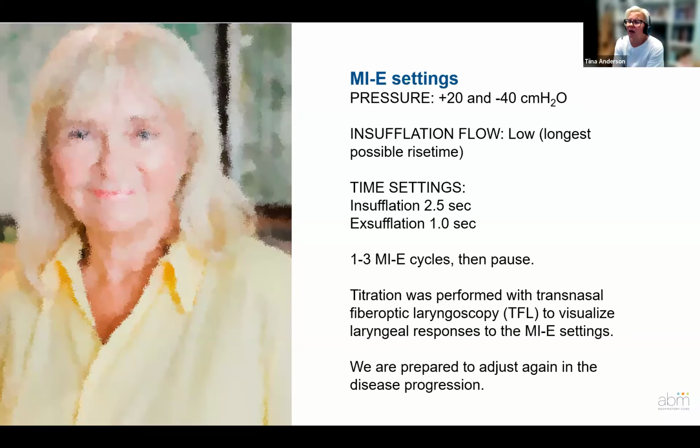And we tried to generate a very, very gentle insufflation using low pressures of 20 centimeters of water with the longest possible rise time and a little bit longer insufflation time of 2.5 seconds. That was combined with minus 40 centimeters of exsufflation in 1 second.